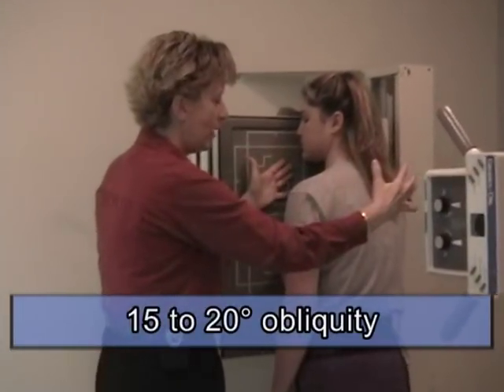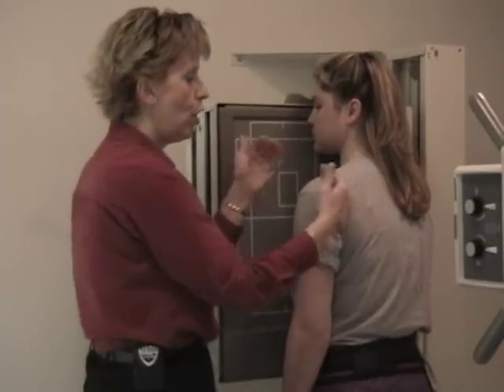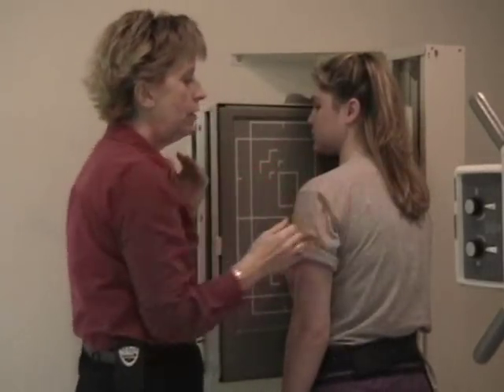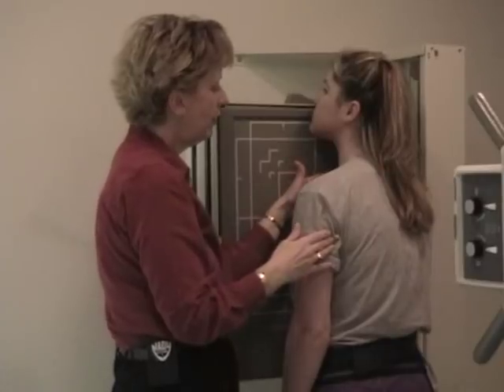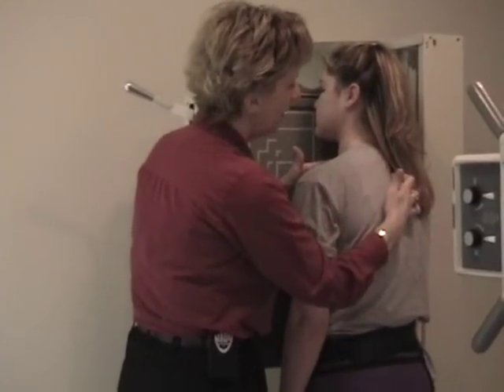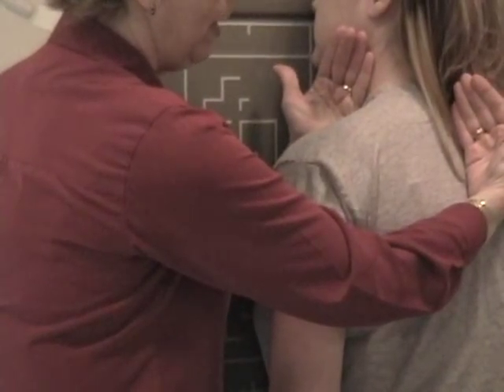The more round the patient is, the less you need to oblique them. The more oval the patient is, narrow and long, the more you need to oblique the patient. But a trick that you can use is you put your fingers on the manubrial notch of the sternum and you feel for the spinous process, and you're evaluating the relationship of your hands.